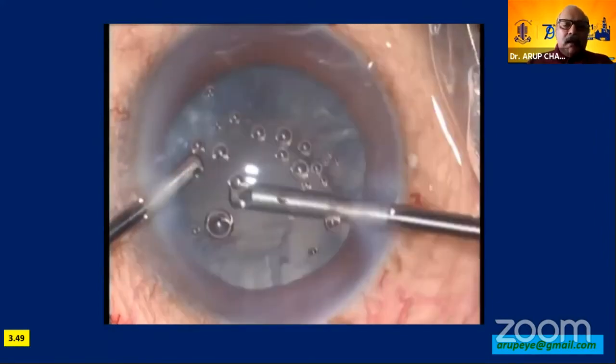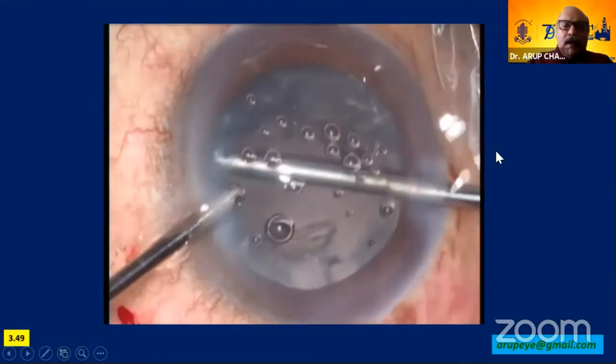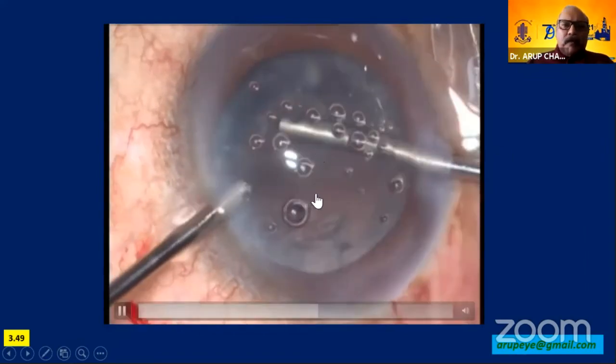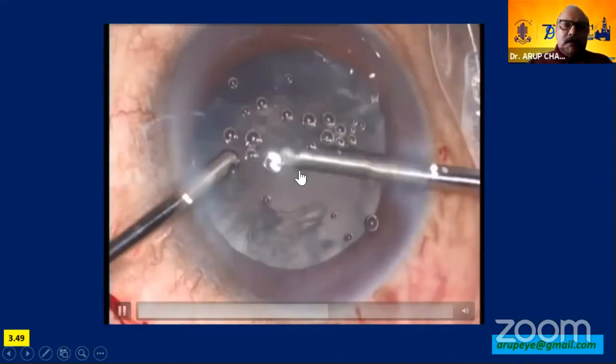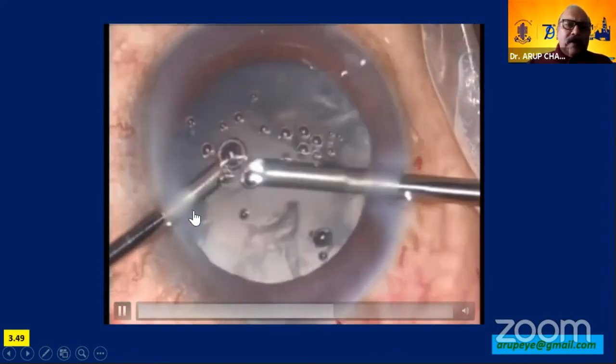So anyway, limbal vitrectomy is performed. 1:2 dilution, triamcinolone acetonide staining. It's very important for us to visualize the vitreous. So after the vitrectomy was done, I thought I'll use the same cutter, the irrigation aspiration cutting mode. This is actually a dual linear control phaco machine. So that was going on, but somehow it was not happening very smoothly.